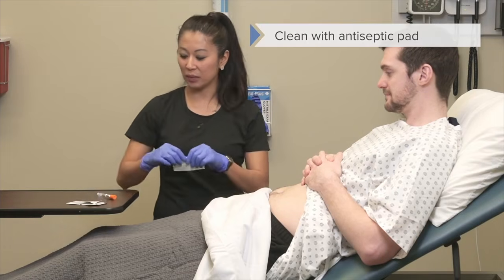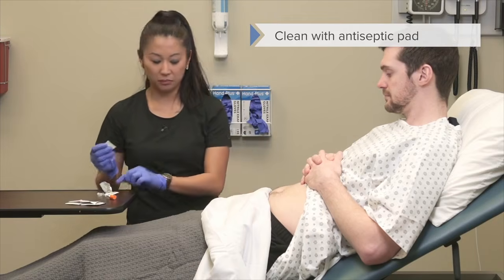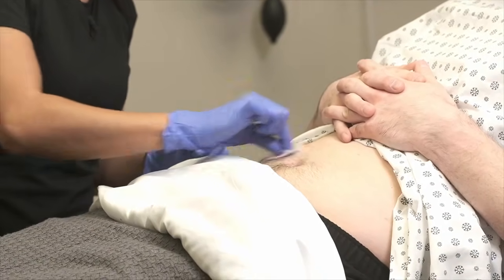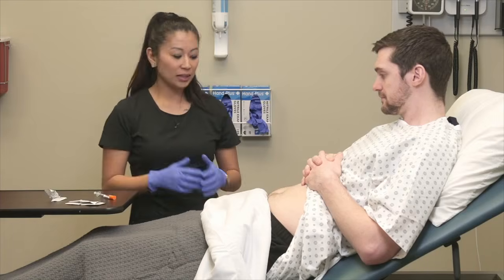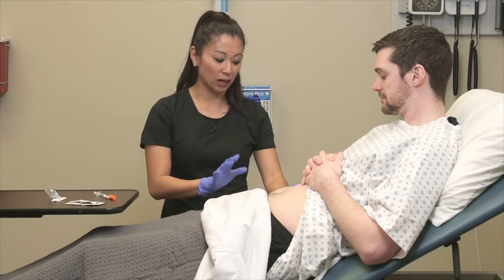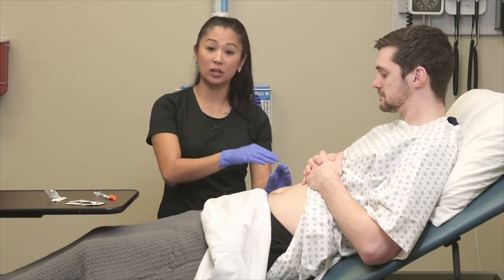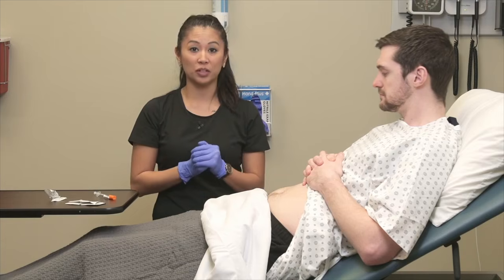Alright, so now we're going to prepare our site and we're going to make sure we clean thoroughly. This can be kind of cold for your patient, so make sure you scrub and clean your site appropriately. Then when we go to give the injection, I'm going to grasp the patient's skin where I'm going to inject. When I do that, I don't need to pinch really hard or pinch really narrow because I don't want to get my fingers in the way. I also don't want to make it painful for the patient.